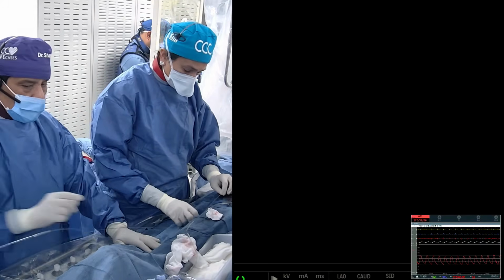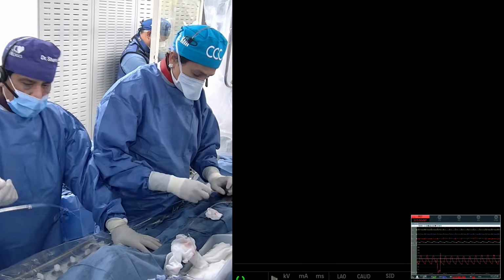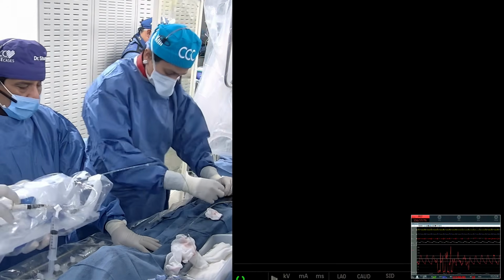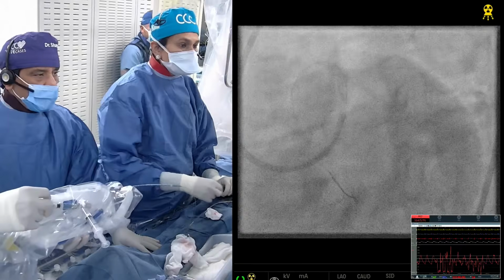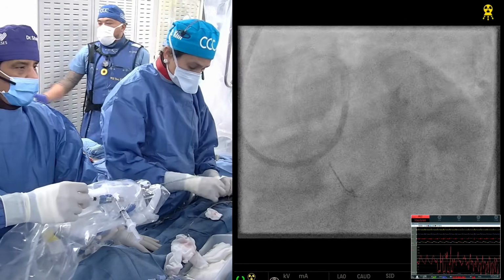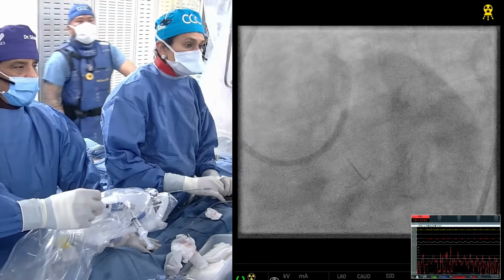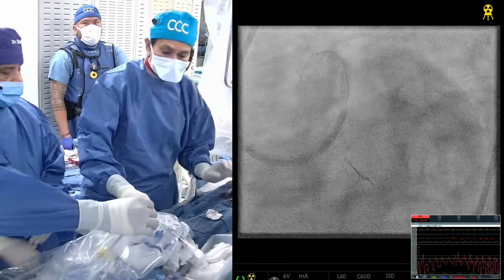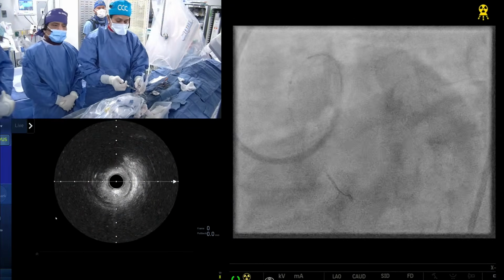All the people say that you manually advance into the vessel and then we start the crown and then pull back, like retrograde orbital atherectomy, but we don't do it. So yes, aorto-ostial, no orbital. In non-aorto-ostial, like this case, orbital is completely fine. You take the rotor wire out.